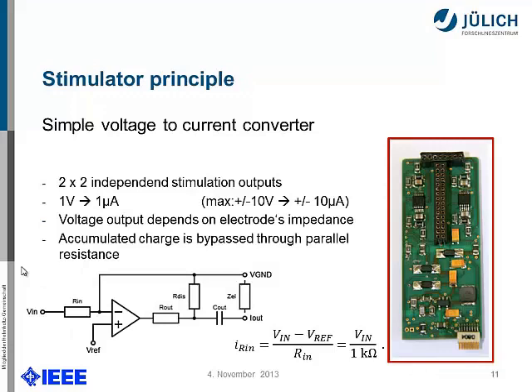If you flip the board, we placed the stimulator front-end on the other side. We have two times two independent stimulation outputs — that's because we only have two DACs on the microcontroller, but we split the channels so we can use many outputs. With a simple voltage-to-current converter, the output range of ±10 microamperes would be sufficient for the beginning. The accumulated charge that might enter the tissue is bypassed via a parallel discharge path.